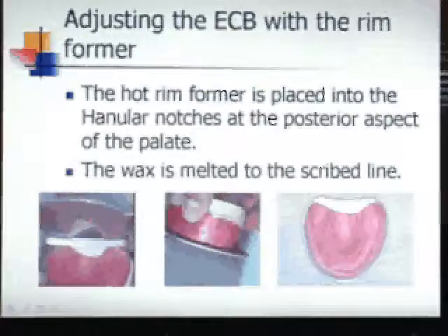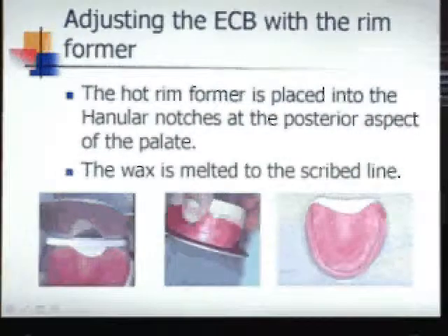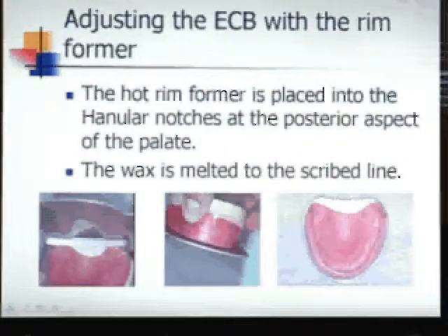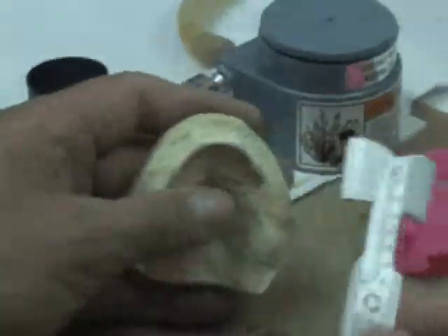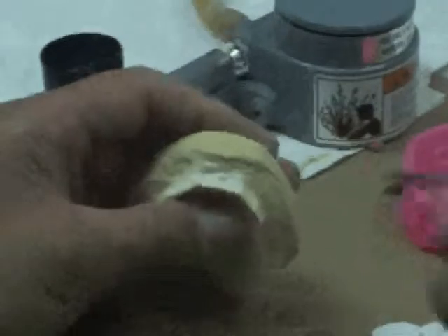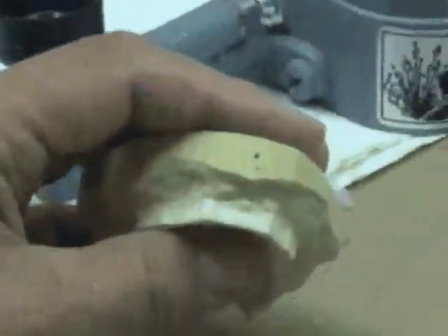This flat plane is the plane of occlusion and is accurate 90% of the time. The ECB is ready for try-in. This is the Papilla Meter. Our first step is to make a little hole up here in the stone as a reference point. I'll mark it with a pencil so you can see it better. But that's our reference point.